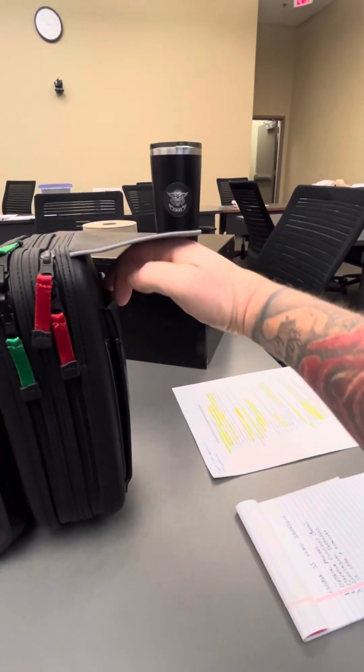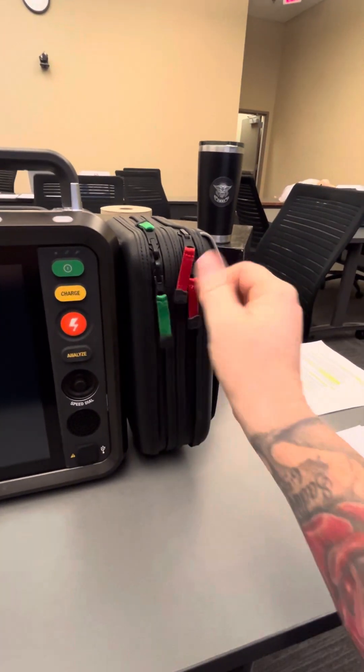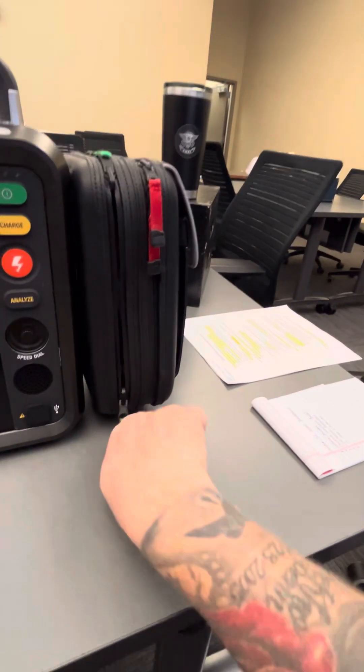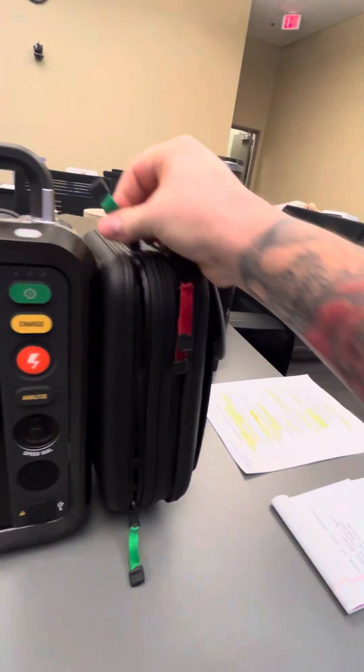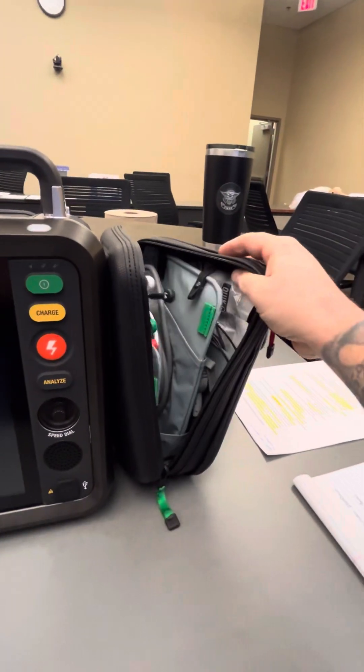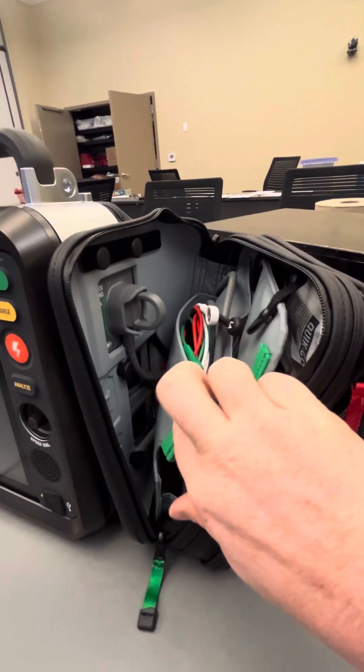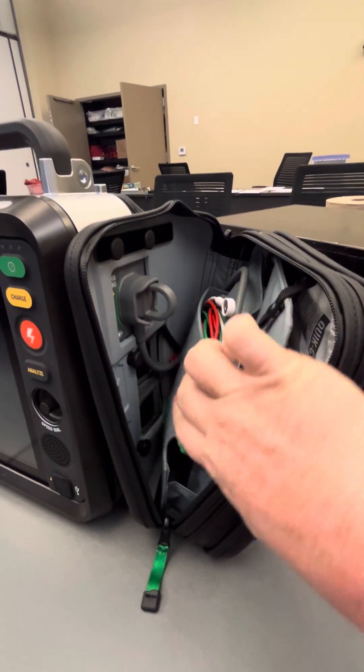Moving over to the right side, you have your magnetic pouch. There is a green and red zipper pouch — it is all the same pouch, divided by a separator in the middle. In the green section, you have your three-lead cables, and you can see where they plug into the monitor.